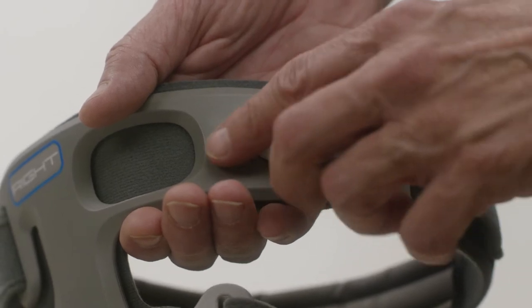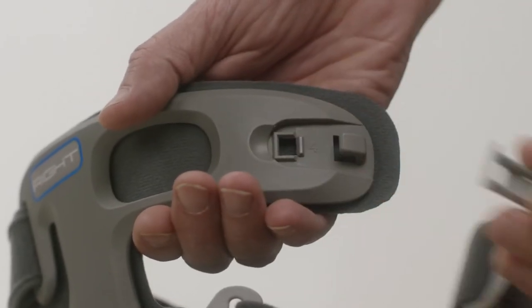Step 1: Release buckles. Release all buckles by lifting thumb tabs. Detach clasps from frame.